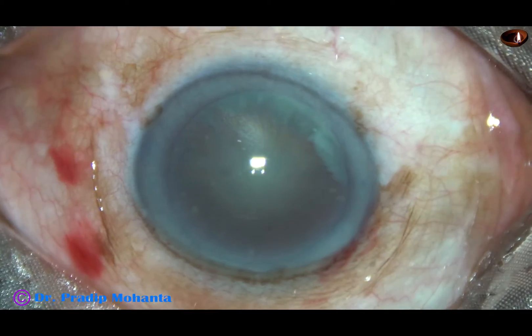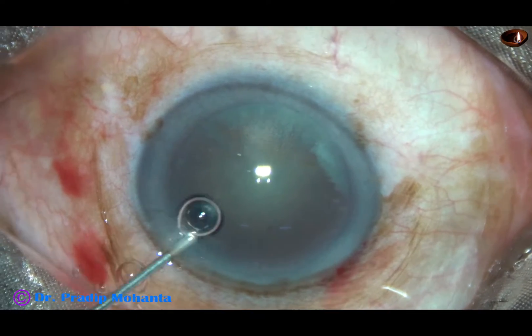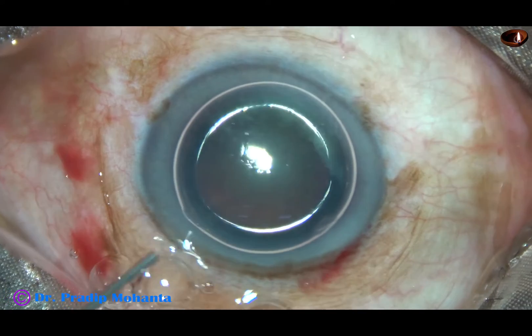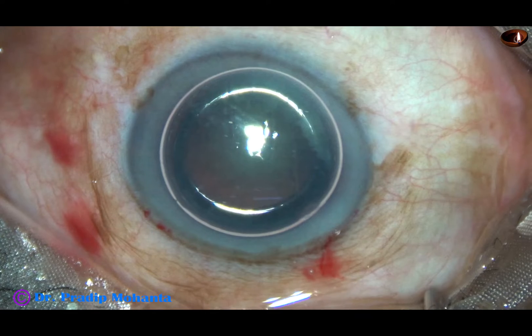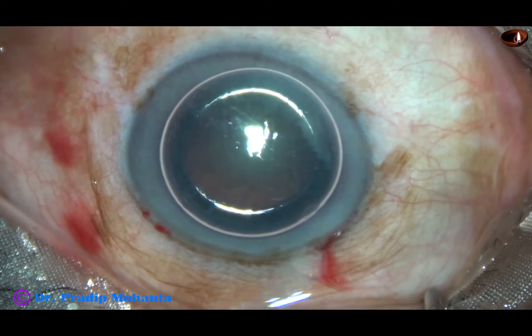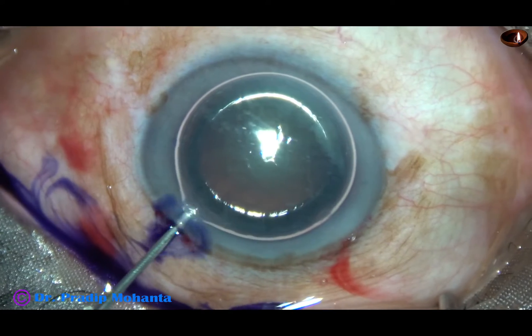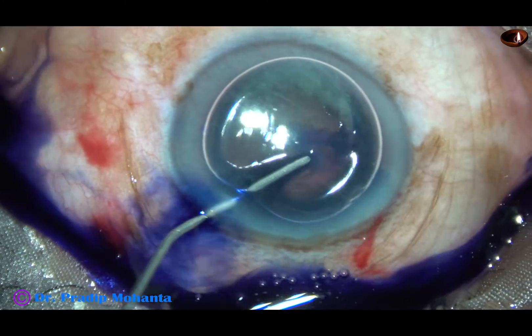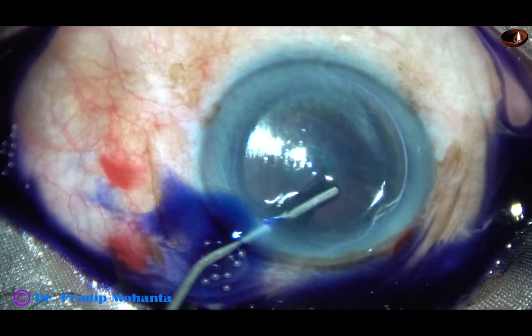In this technique, we learn both. We learn to make a trench. We learn to hold the nuclear pieces and chop the nuclear pieces. So after doing stop and chop for a few months, a fresh surgeon can go for direct chop.